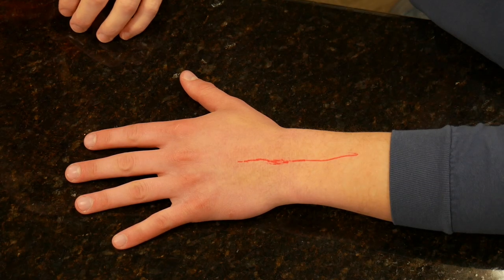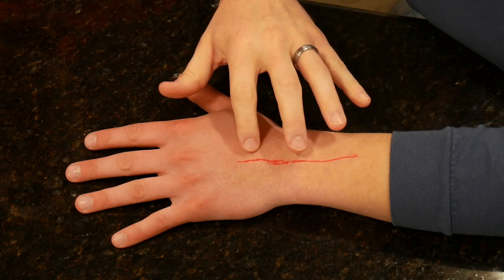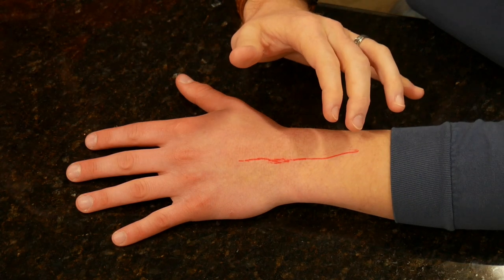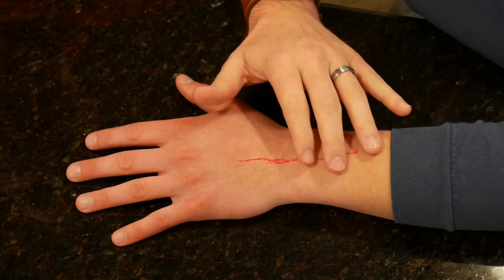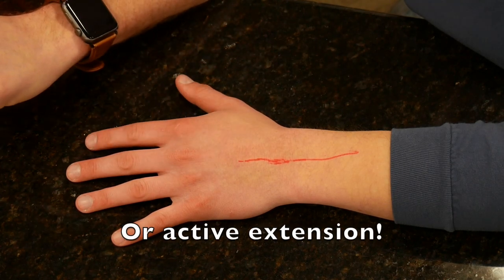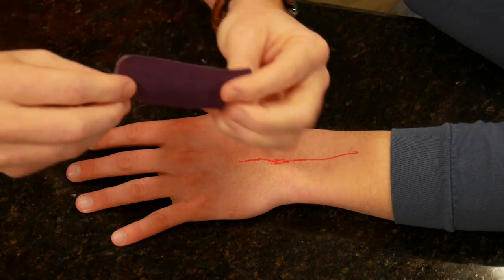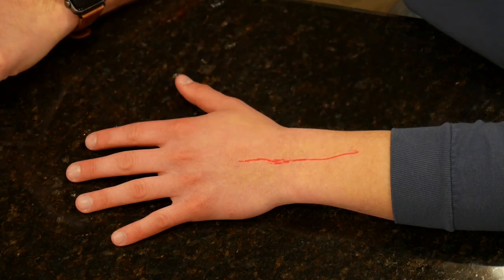If you have patients with a scar on the dorsal side of the wrist or hand, you know that you run the risk of having some scar adhesions on the extensor side of the wrist and hand that would cause limited flexion. So we're going to show you a quick little trick today with a very small piece of KT tape that can help loosen some of those scar adhesions.